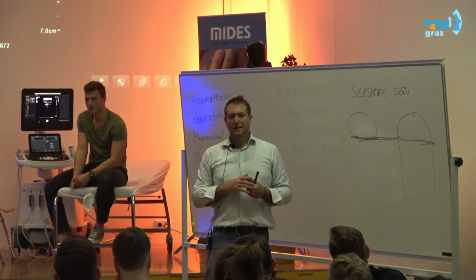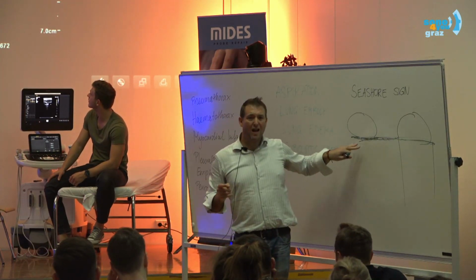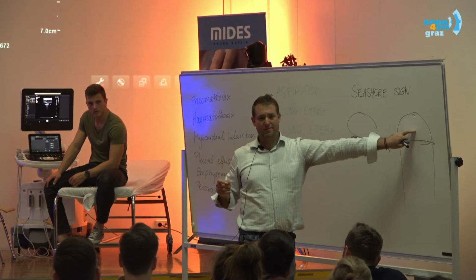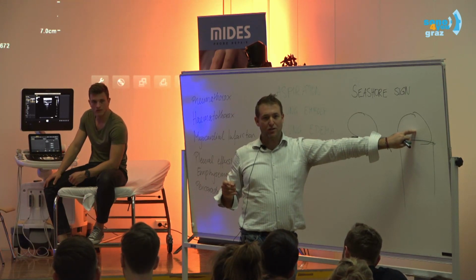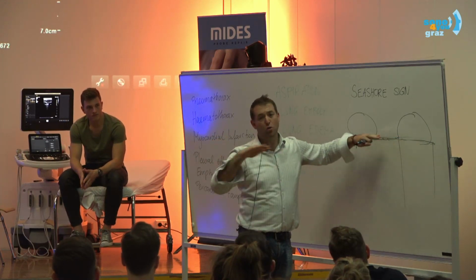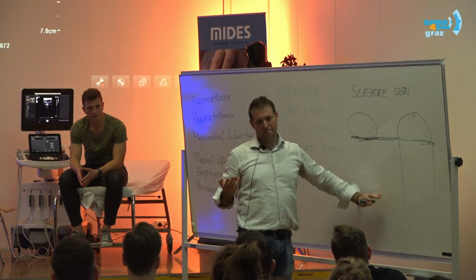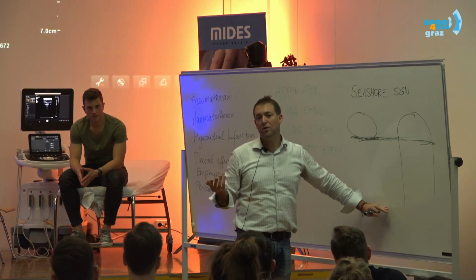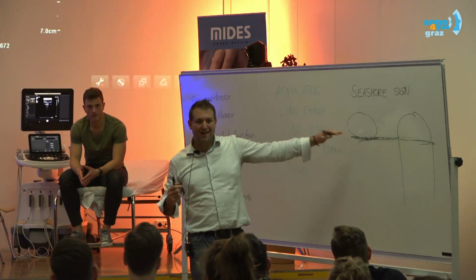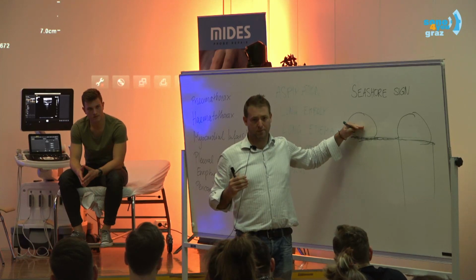Makes sense. Well, actually, there is only one absolute. The pleural line is that which is just beneath the ribs. Because in pneumothorax, as we will see later, this line will be frozen, not moving, so how can you know? And then there might be other lines below, A lines, and how will you know? The only way you can know, by definition, is parietal and visceral pleura are just next below the ribs, okay?